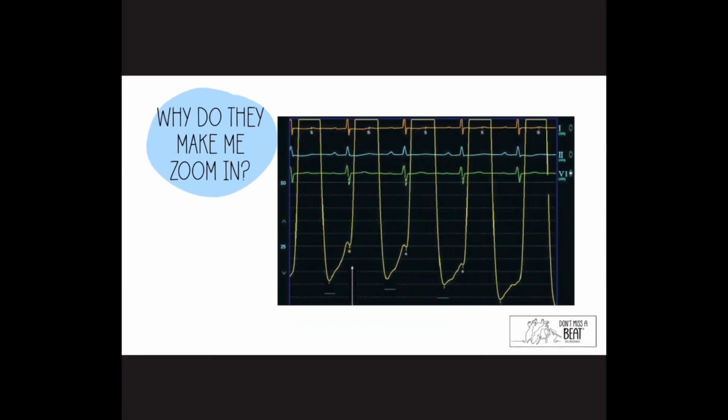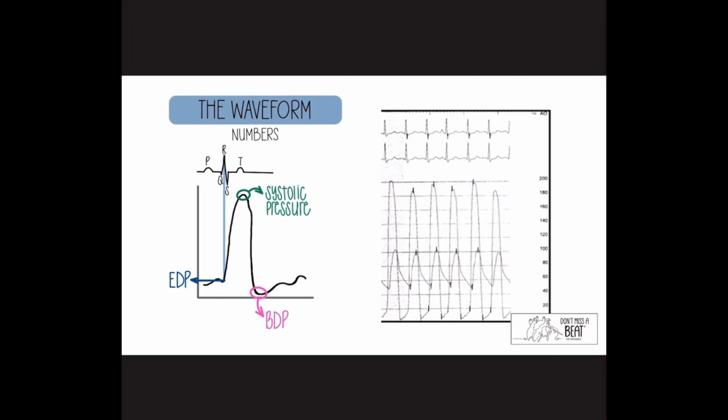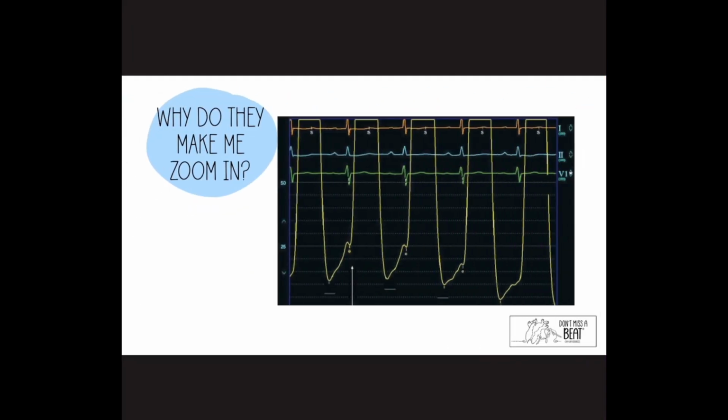But also, if you forgot to snap a full LV pressure, don't worry, because this screen actually did capture the measurement for you and the full waveform for you. You just aren't actually seeing it on the screen.